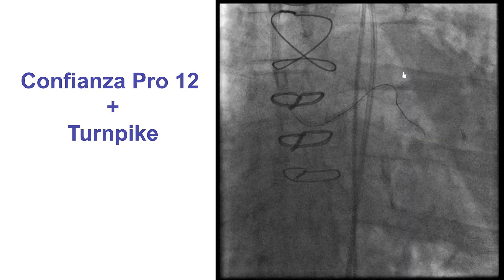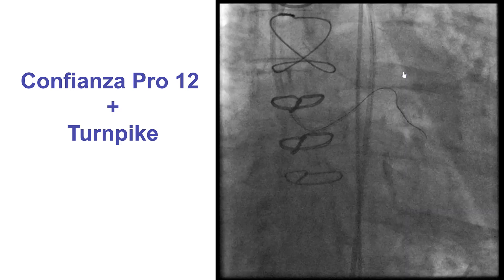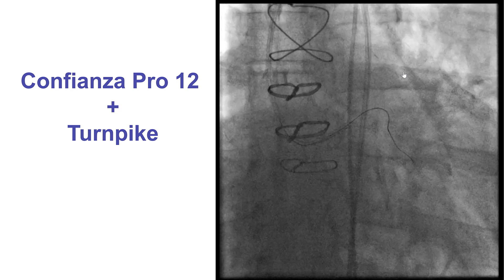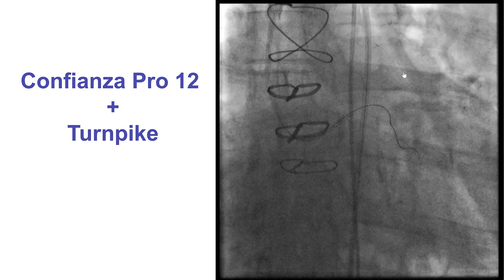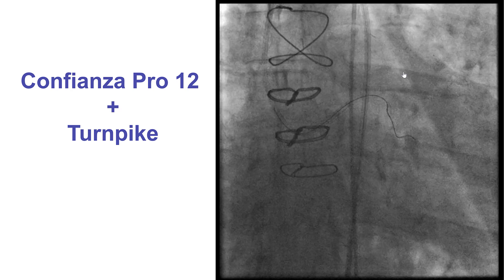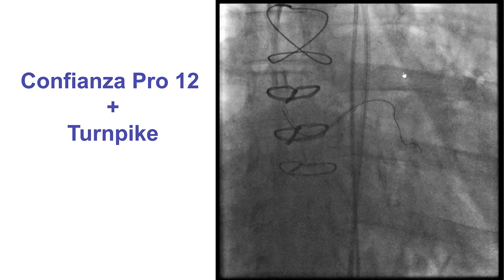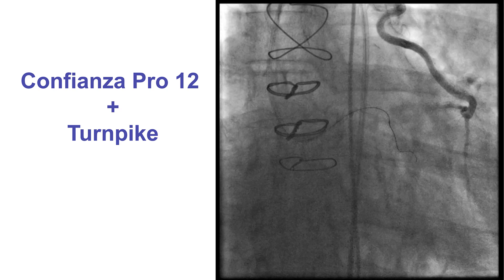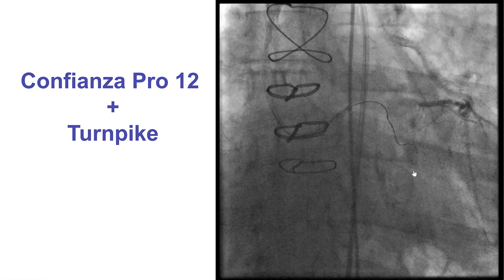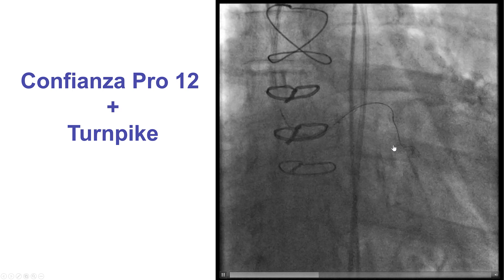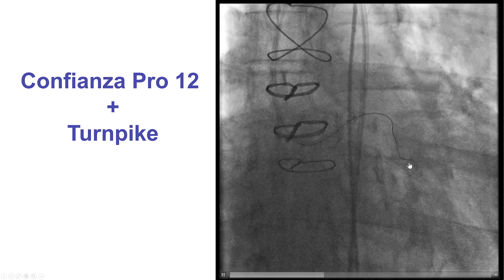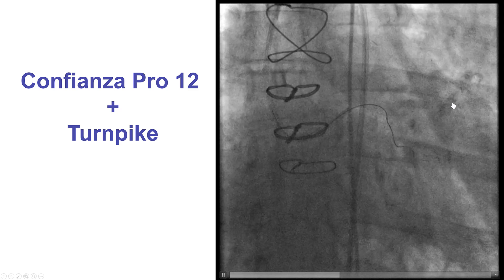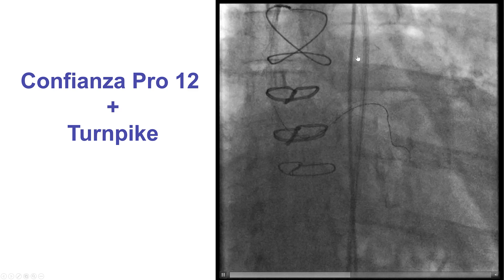Going through the left main and the circumflex was quite challenging and required multiple microcatheters and guide wires including Confianza Pro 12, Fielder XT, and Pilot 200. After multiple attempts, the wire finally advanced subintimally into the course of the circumflex, as shown by injection through the LIMA.